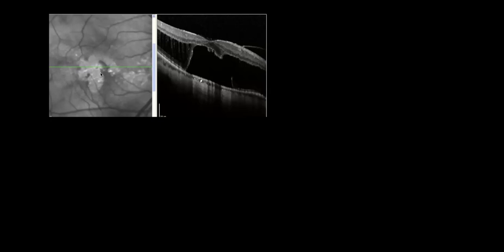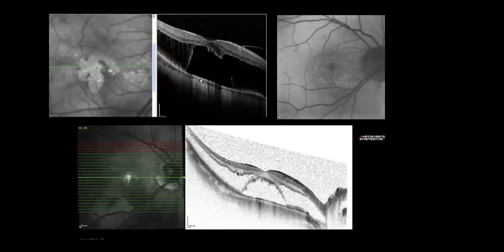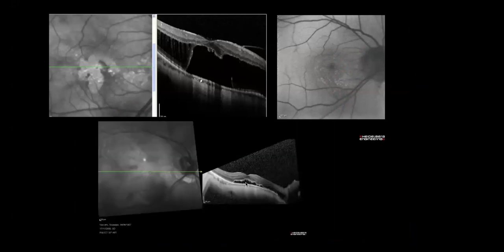The first thing you think about is macular atrophy. So I was expecting to see all black in the autofluorescence. Instead, it was normal. And in the color fundus, you would expect to see a yellow area. Instead, the fovea was normal. So I was thinking, what is this? This is not atrophy of the RPE. In fact, after the operation, I could obtain a complete disappearance of that whitish area in the infrared image.